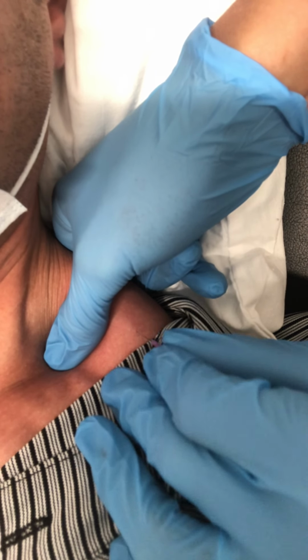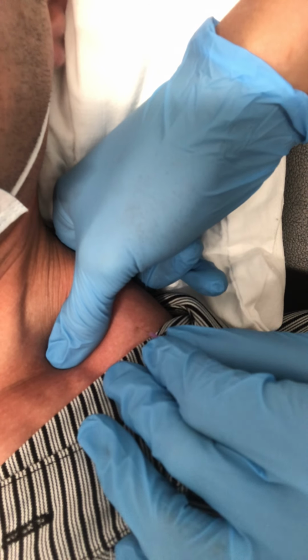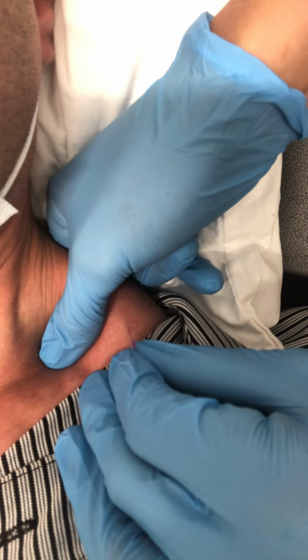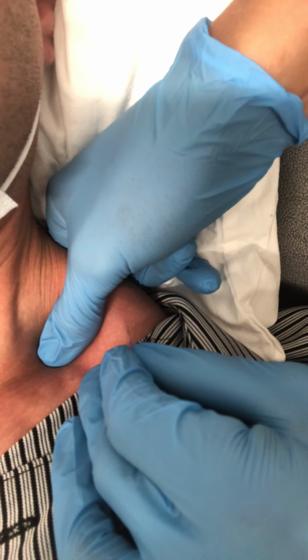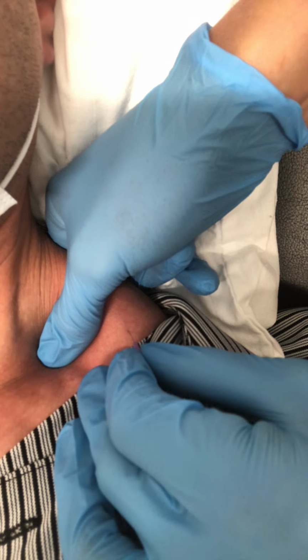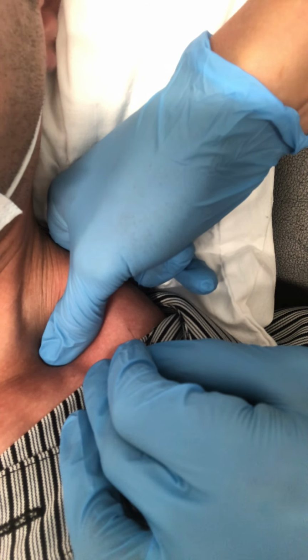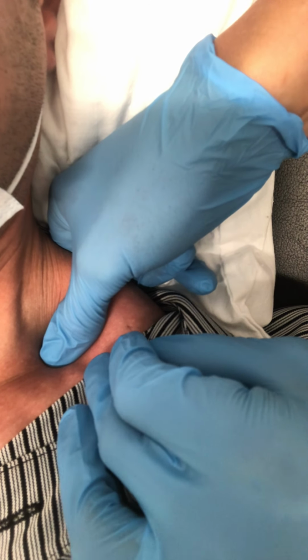So I'm going to kind of pack that a little bit so we get any more responses there in that area. Mm-hmm. Feel a little smaller ones, not enough to pick up on the camera, but there's some smaller ones. Oh, there we go. Got a really good achy sensation right now. And sometimes what we do is we'll twist the needle a little bit to really engage that connective tissue and get that tissue to wrap around the needle. And then ask him if it's grabbing, how it really grabs at that tissue.